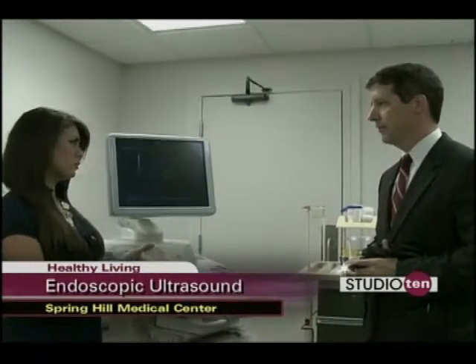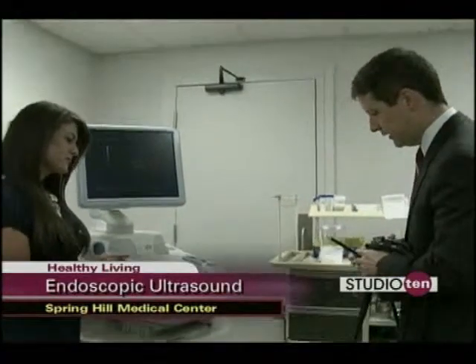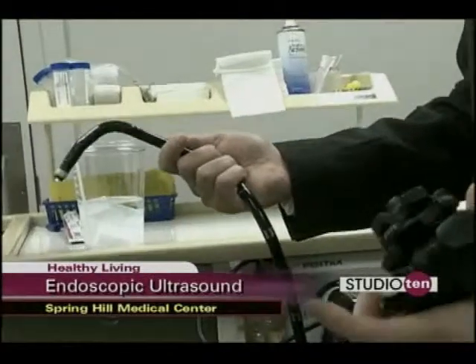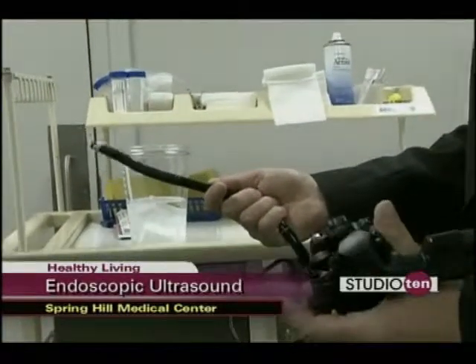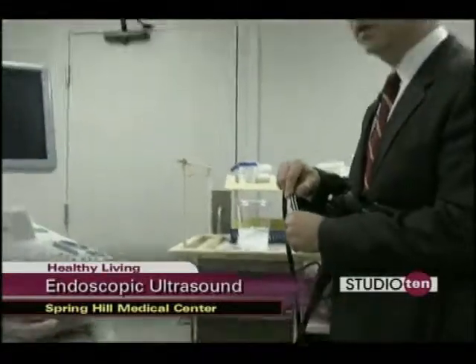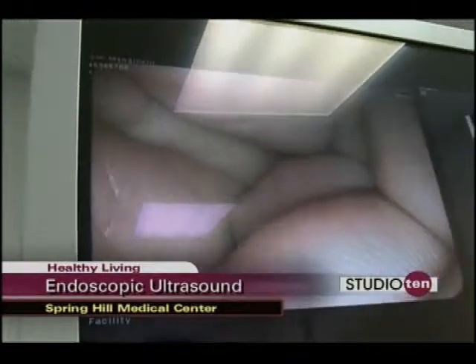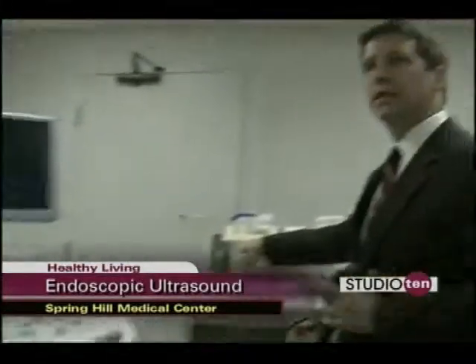So maybe other tests are run before we go to this? Correct. This is the scope here — we can actually drive the scope by using these dials, very similar to a regular endoscope. We have the light source here, and as we do this you can see images of my hand, giving you a nice endoscopic image. And then at the same time on the image to the right, we can see the ultrasound images.